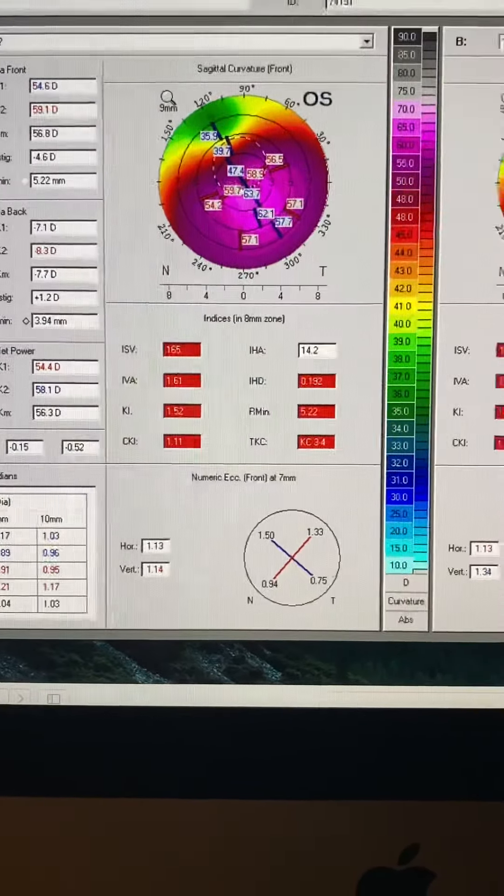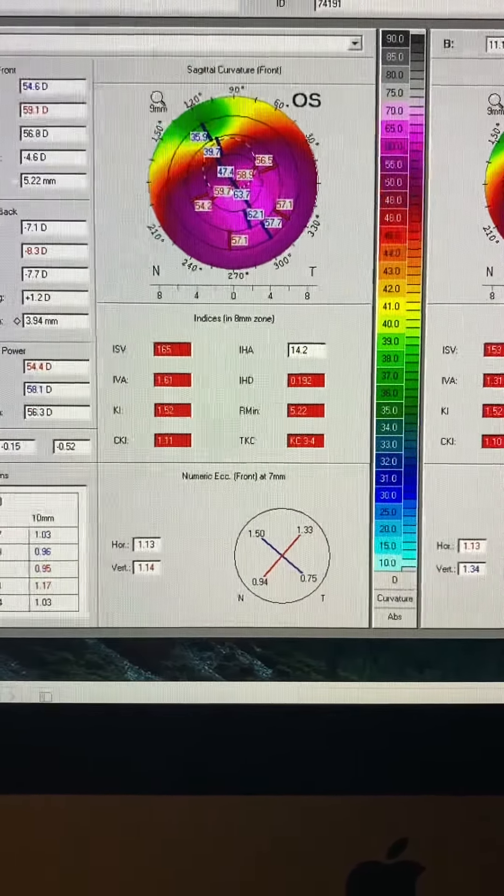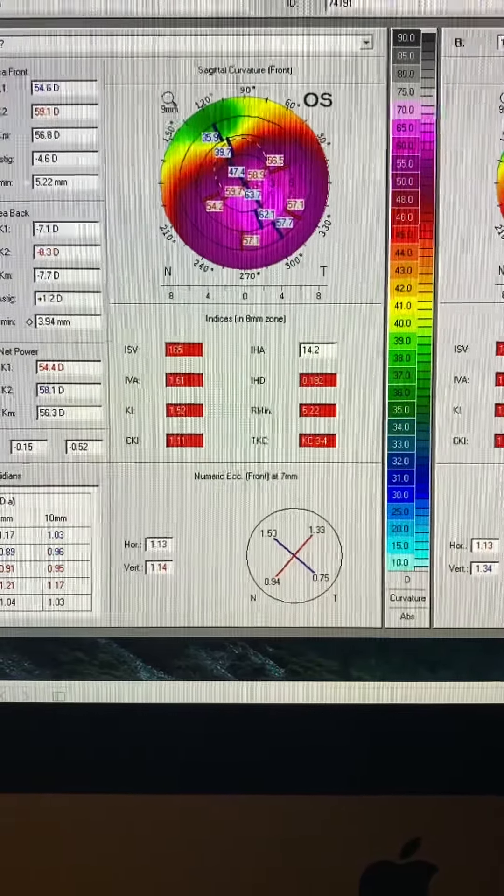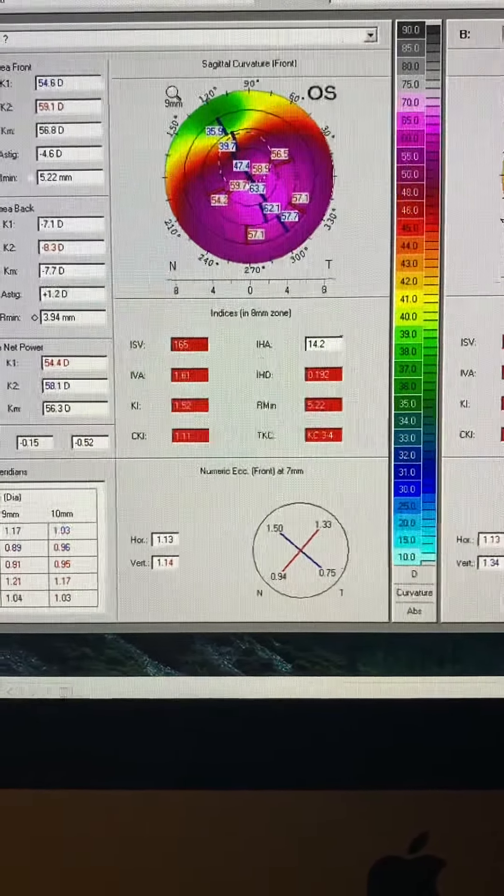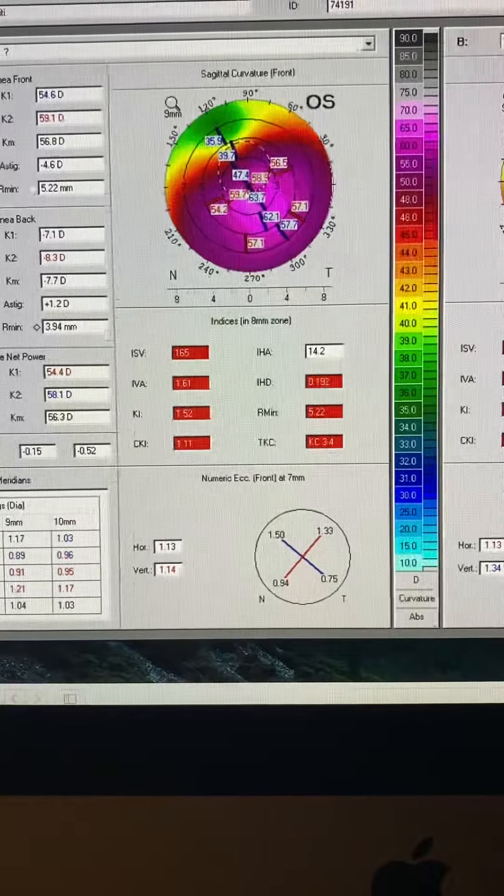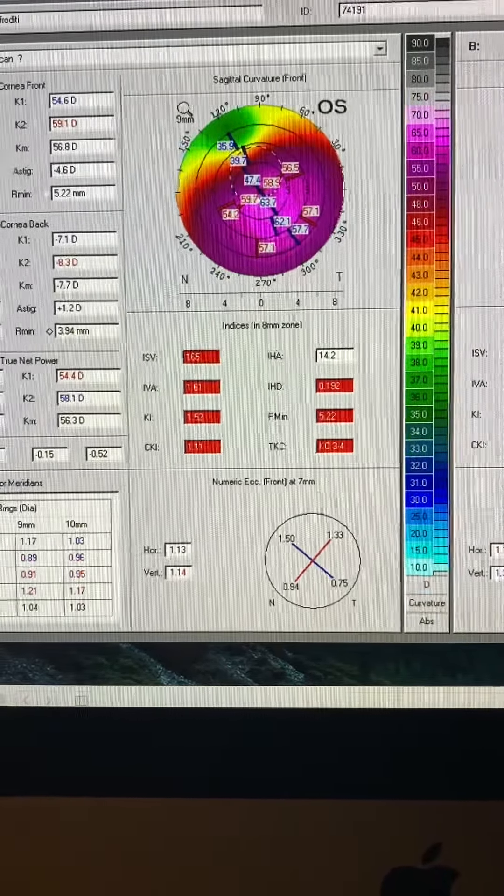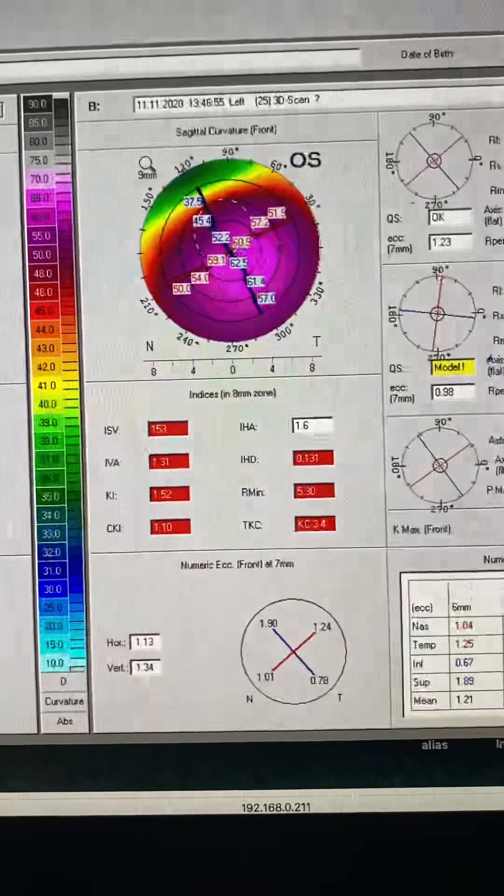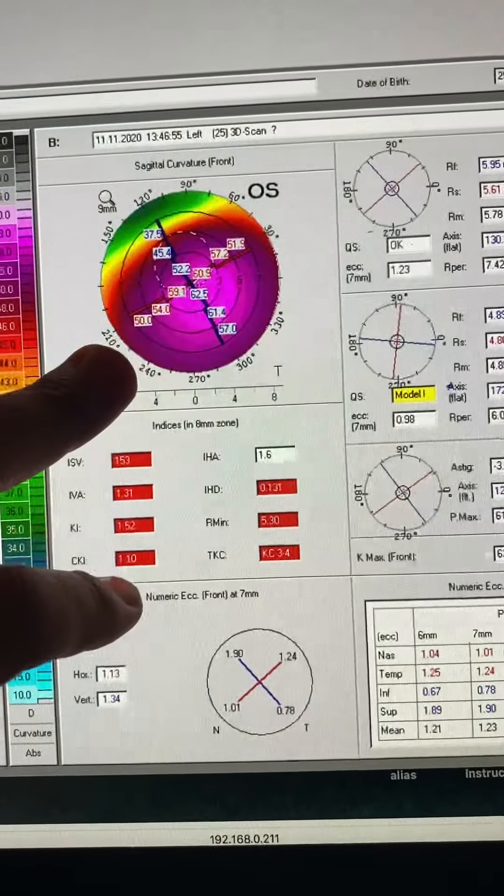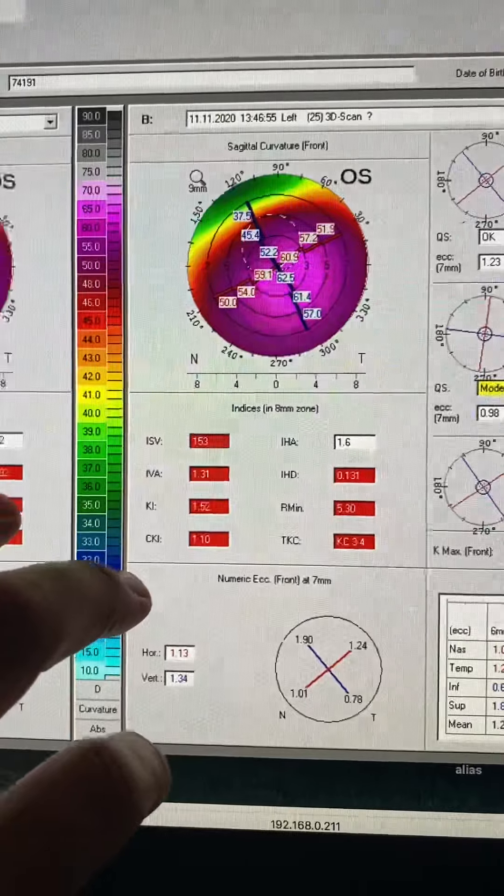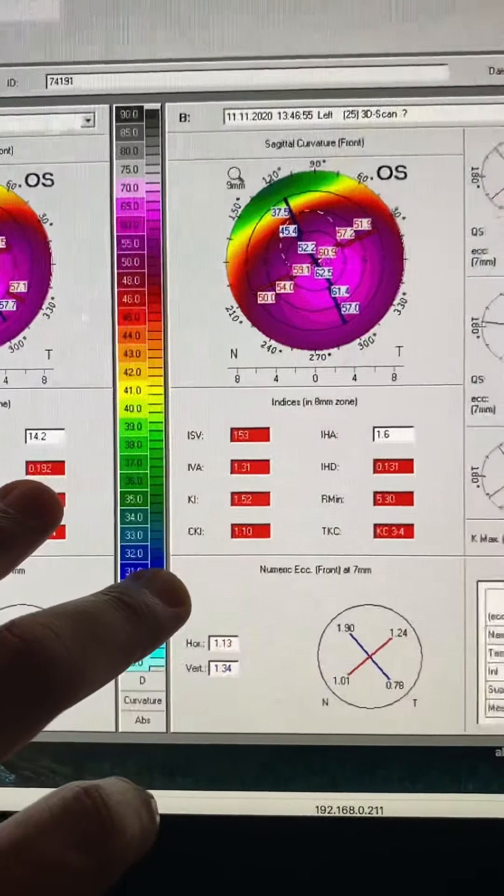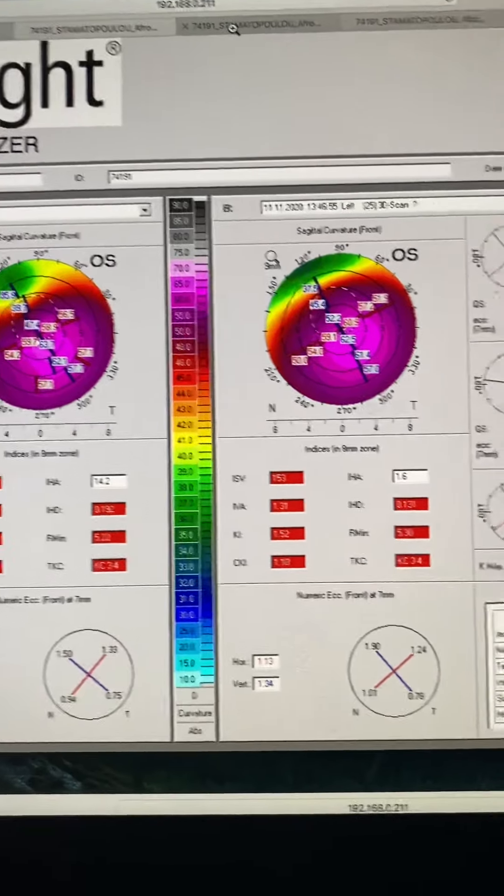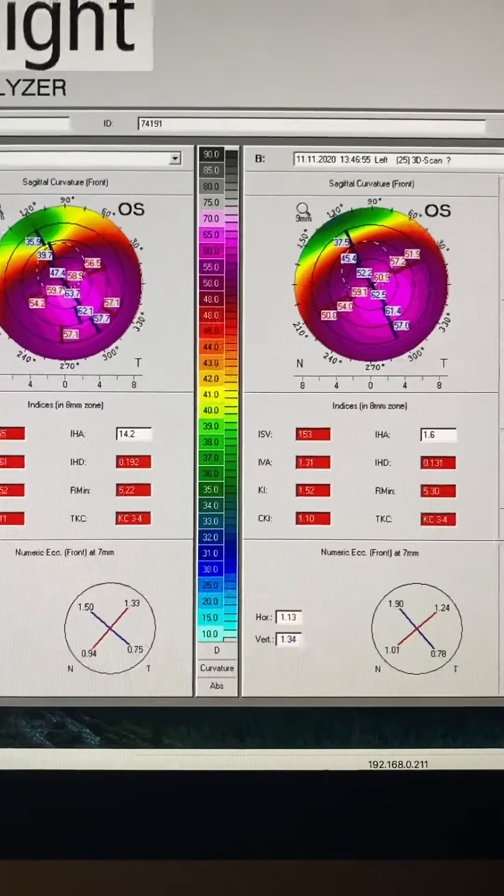we treated no refractive error or significant topography correction because the cornea was very thin to begin with. And thus, the improvement is small. We're about two or three diopters better. Although the IHD has almost halved, went from 192 to 131 in the left eye. Let's look at the other eye.